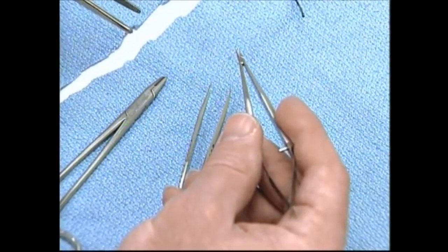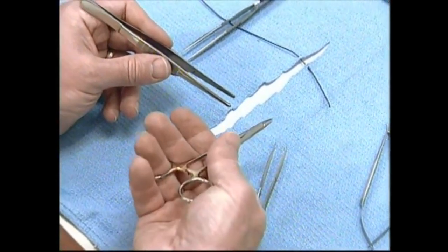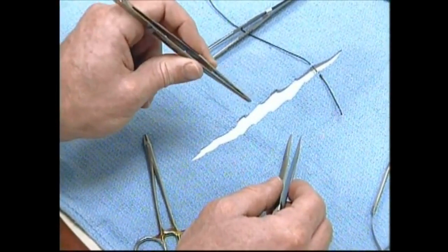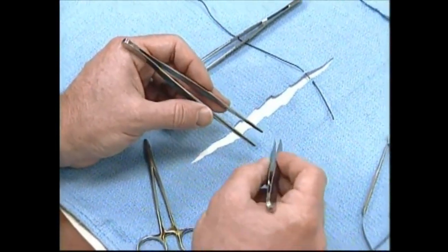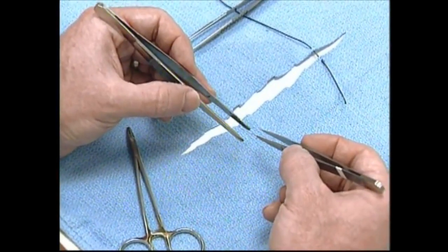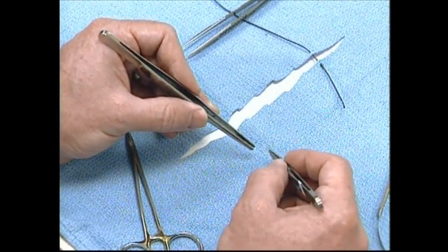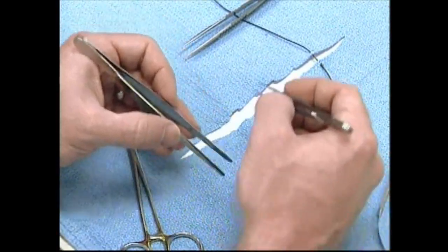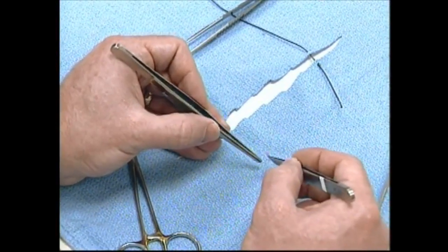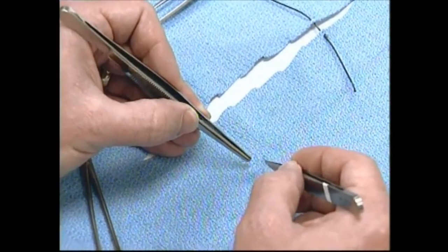The second main difference is that we don't hold the instrument similar to a needle holder. We hold both instruments with a pencil-type grip — the left hand already uses a pencil-type grip, and in the right hand we also use a pencil-type grip. To the outside observer, when doing microsurgery, it doesn't appear as though the microsurgeon is doing very much, because the hands are not moving. The motion comes through the fingertips, and there's very minimal translation that occurs in order to accomplish the microsuturing.